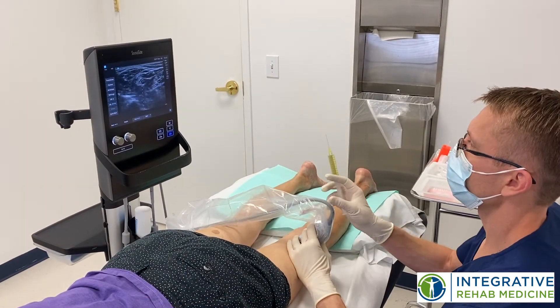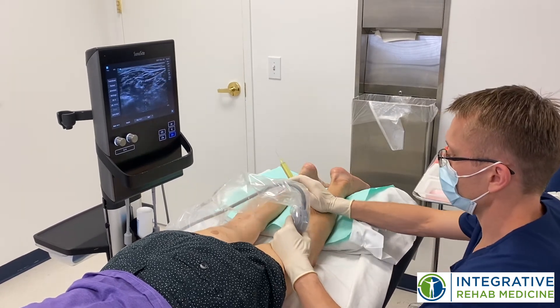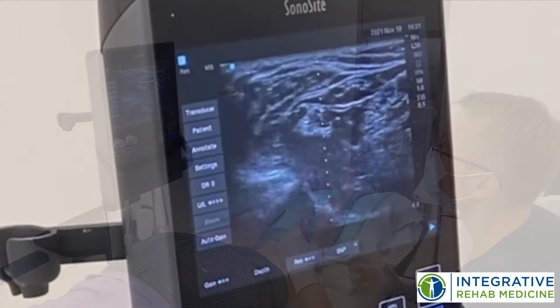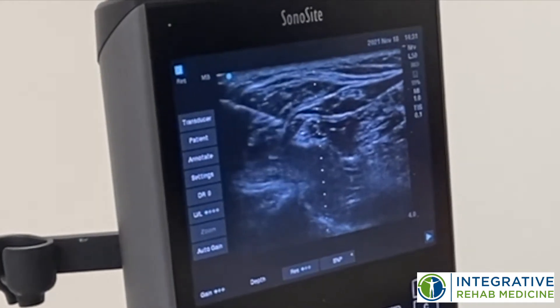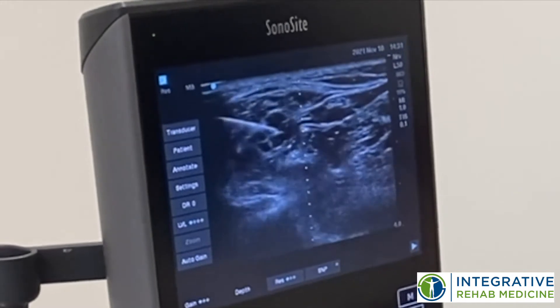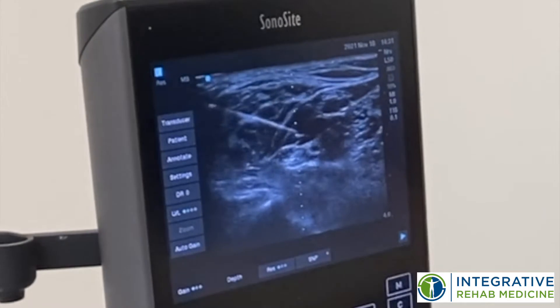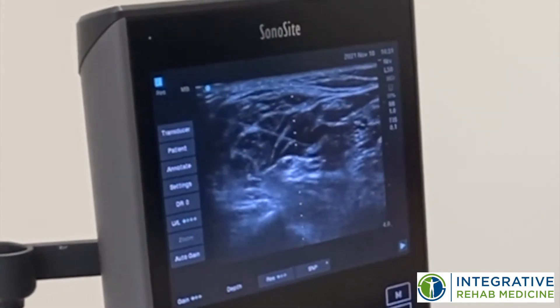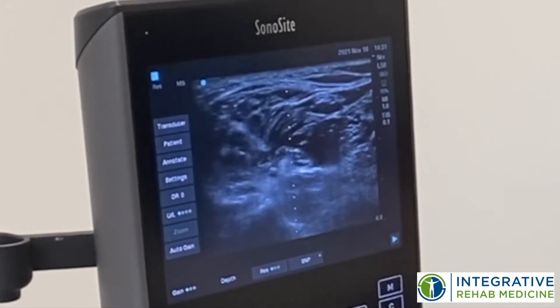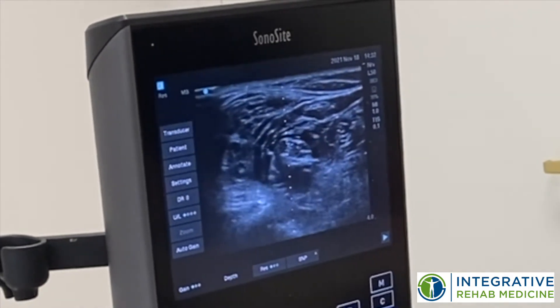So what I'm doing, I'm scanning and I'm finding the sciatic nerve, and I'm going to inject some of the plasma around the sciatic nerve to release it and to provide the nutrients. You can see the needle coming towards the sciatic nerve. And here it is, the plasma spreading around. We're separating any of the tissue up above the sciatic nerve — underneath it, you can see the plasma completely surrounding the nerve.